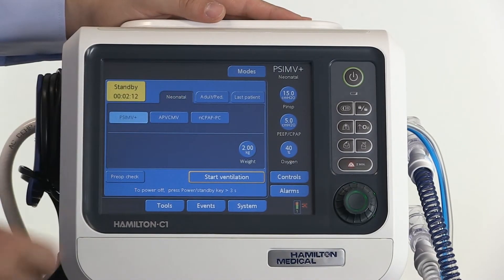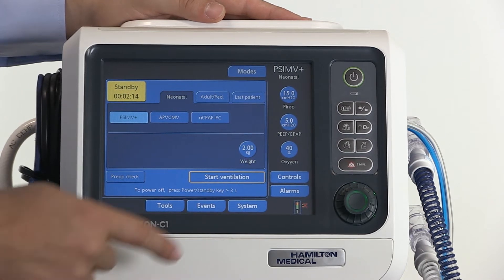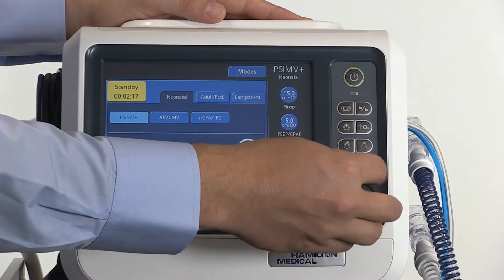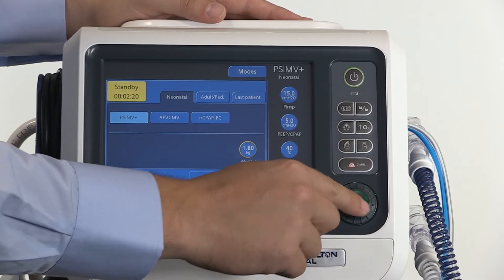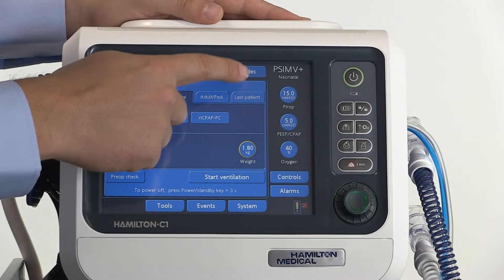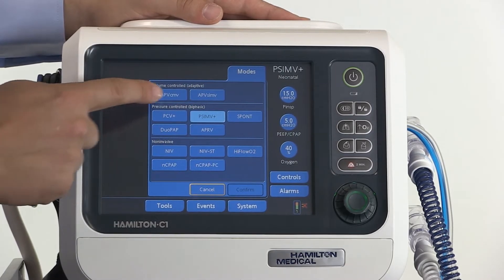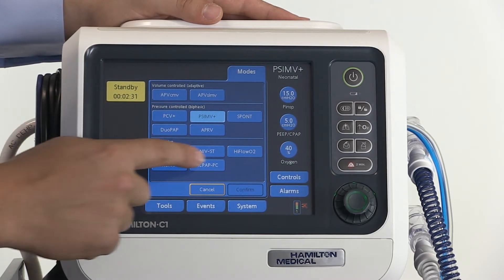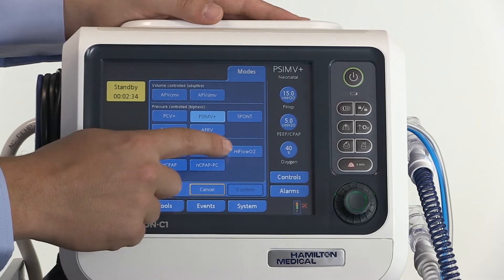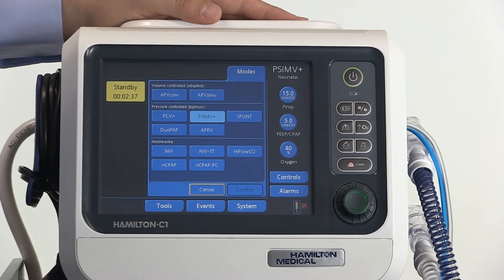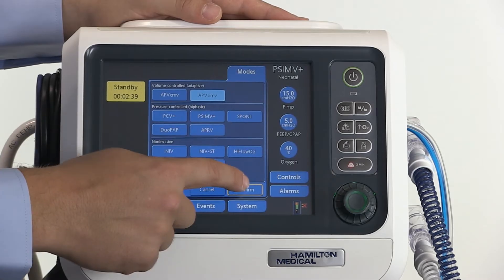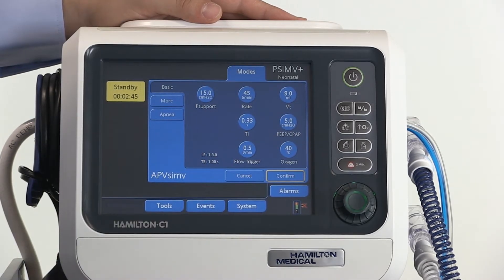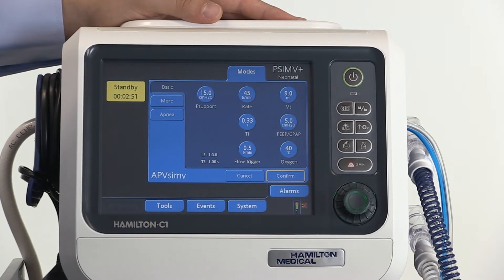While in standby, select the neonatal option, adjust the actual weight of the patient, and then select the ventilation mode. The modes overview is divided into volume adaptive, pressure controlled, and non-invasive modes, including high flow oxygen therapy. Select the desired mode and press confirm. The controls window opens automatically. The default settings for the control parameters and alarms are calculated based on the weight of the patient — check them and adjust if necessary.